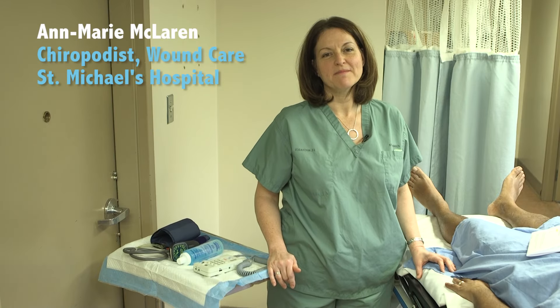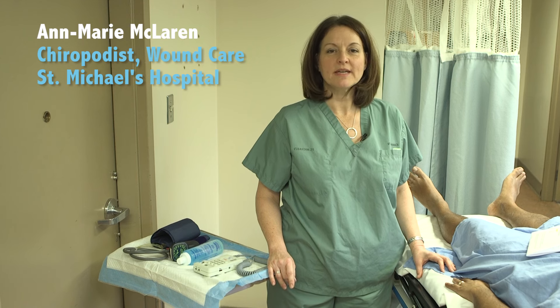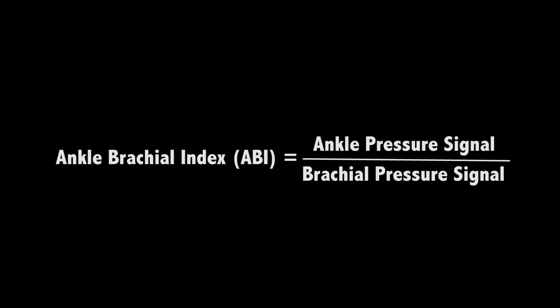Hello, I'm Anne-Marie McLaren. I'm a foot specialist on a wound team in Toronto, Ontario. I'd like to demonstrate how to perform an ankle brachial index using the ankle pressure divided by the brachial pressure.